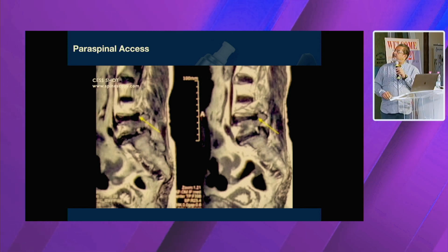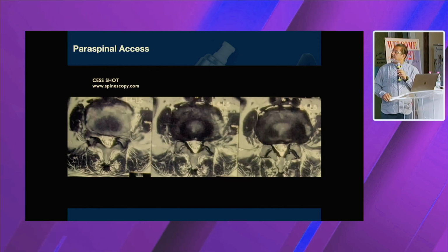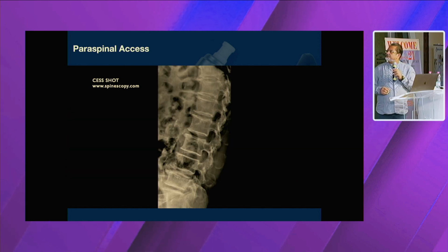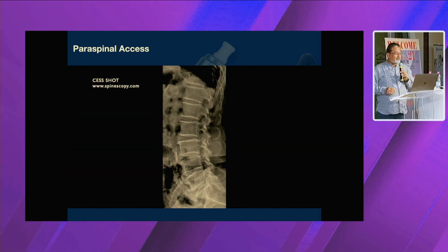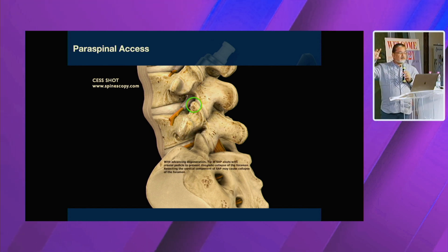So you can see here now, this is the extraforaminal herniation, foraminal extraforaminal herniation. Quite a tight, not a very big herniation, but yeah, quite a tight herniation. So there's no instability in this case. So the classical approach, the stenosis is up, down, or front, back.